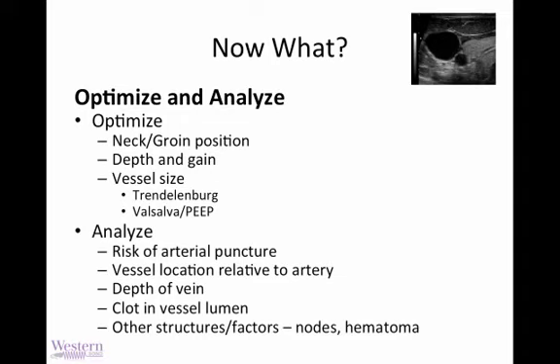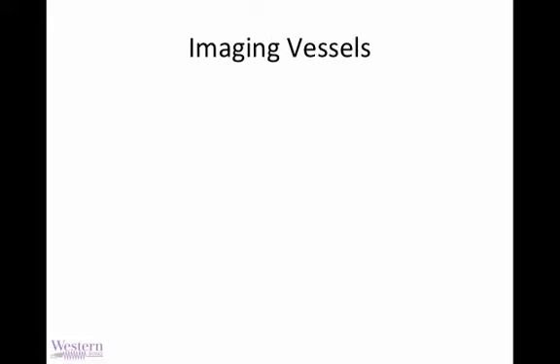And as mentioned, you want to analyze and look for pitfalls or for hazards along the way. Of course, the advantage of being able to see before you stick anything in people is you can have a good look around and look for these kind of problems.